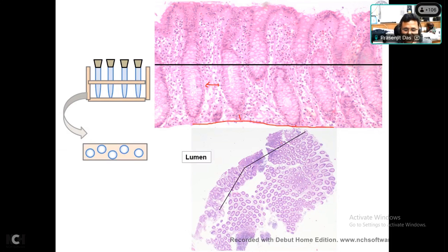Our volunteer, Dr. Harish, has already discussed that there is some inflammation. So now I will draw your attention: the inflammatory cells we can see are on the luminal part only and they are not present in the deeper part of the mucosa. It is always present because all our antigen is present in the lumen. So there will always be some lymphocytes and plasma cells seen in the upper half of the mucosa, but rarely some inflammatory cells will be present in the deeper part.